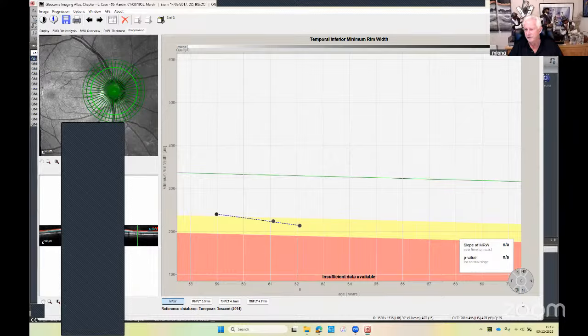If it was a baseline exam and I had a quality of 20, then I would say, please rescan the patient, because we may be able to get a better quality than that. And that comes back to your operator to make sure that they're focused correctly and in the right position. So there's a little bit of technique from the operator perspective. But you do have an indication here, so I'm looking mostly for 30 and above in that quality area.